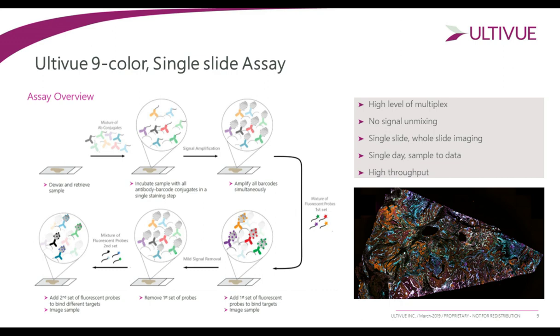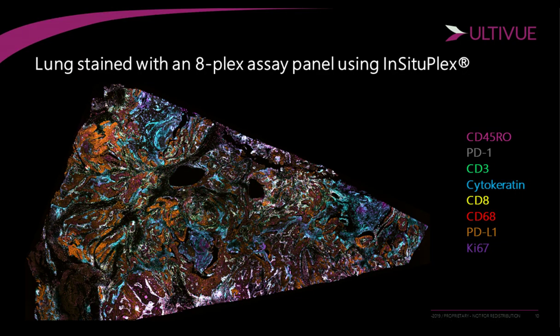And if you think about clinical workflows and research-type workflows for translational research projects, this is much more attainable. This is something that is much more reliable and easy to implement, given slide volume and the types of hardware and personnel that may be available for these types of studies. And here's an example of an 8-plex assay that was done within our services group, an 8-plex image of a non-small cell lung cancer that I just want to quickly highlight.